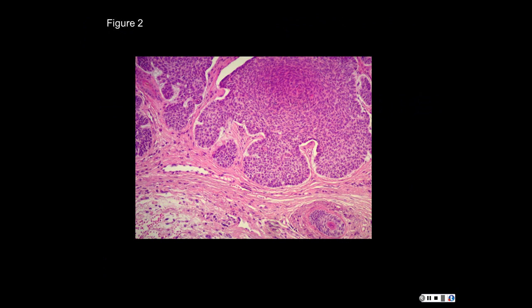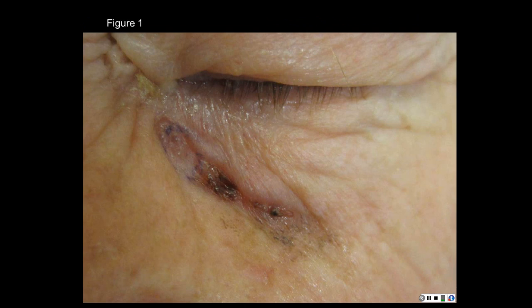So you go back to it clinically. I mean, it's pretty brown. Could be a pigmented basal cell. Look over here. This area has little flecks like a pigmented basal cell. This area has more of an irregular pigment network. Exactly. And then look at the rest of this. That's basal cell. This is all lentigo maligna, and it's colonizing.